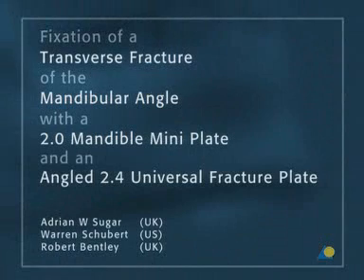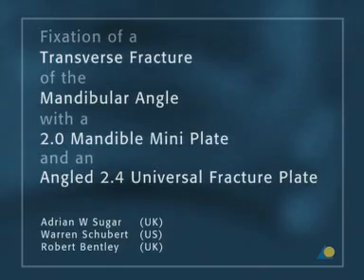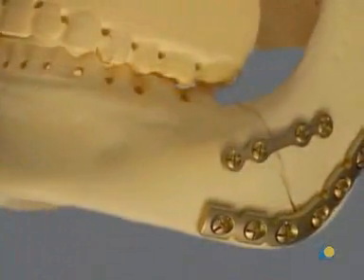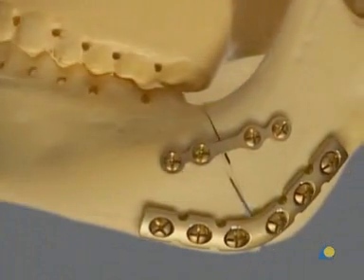A transverse fracture of the mandibular angle will be fixed with a 2.0 mandible mini plate at the upper border and an angled 2.4 universal fracture plate at the lower border.